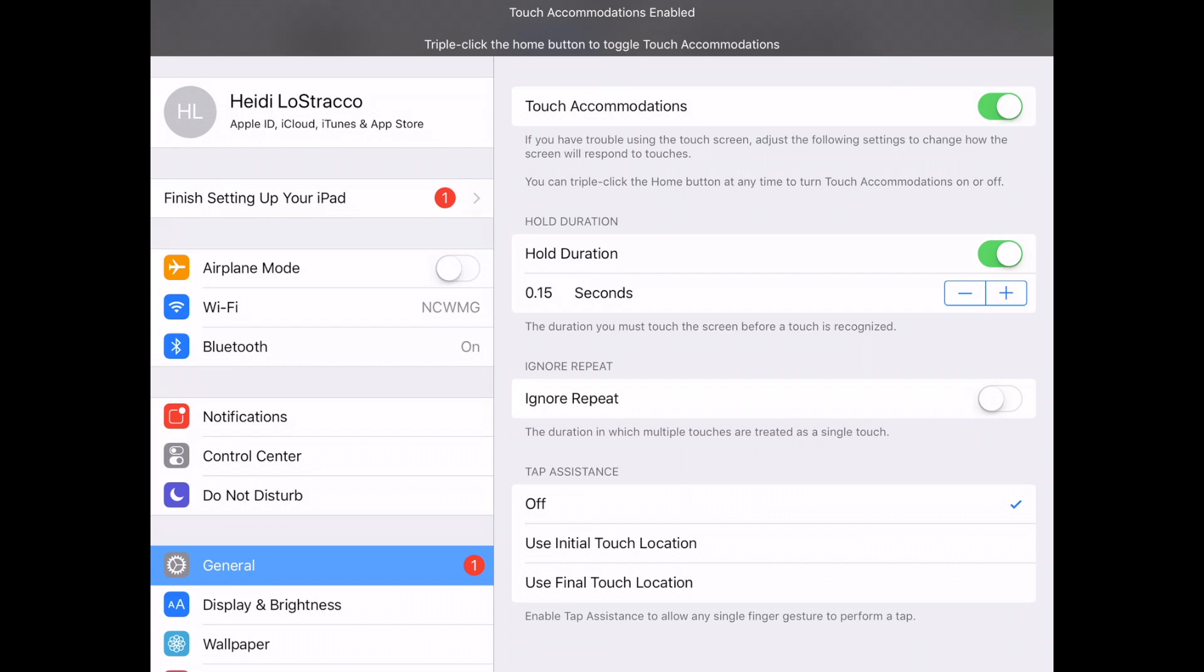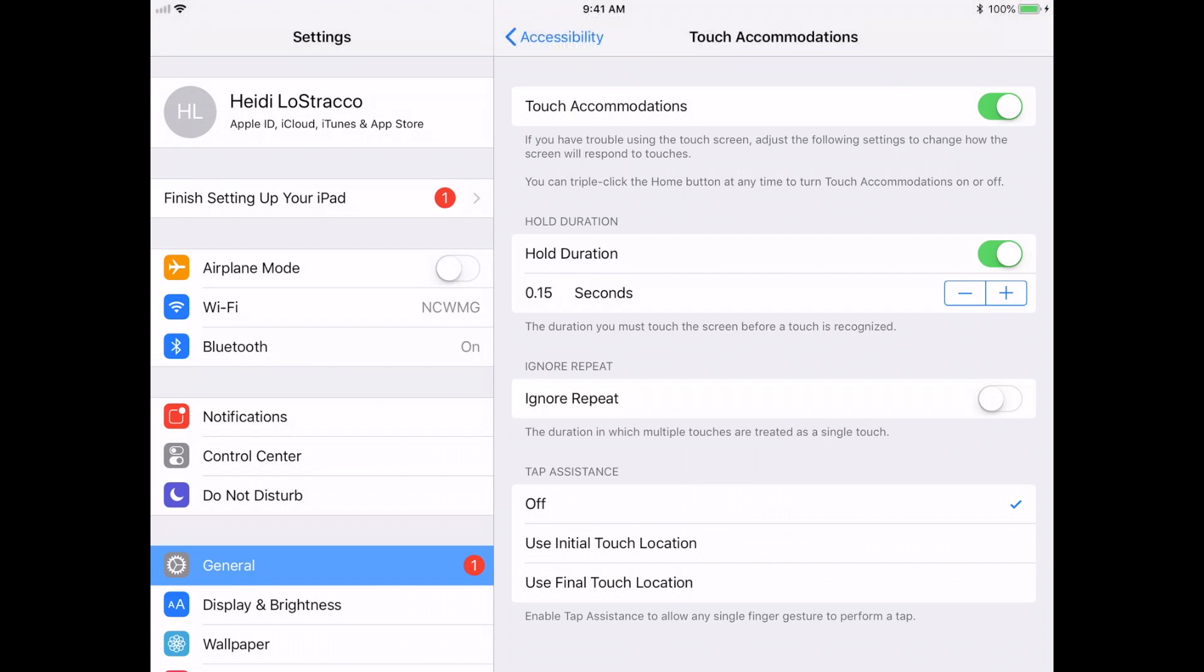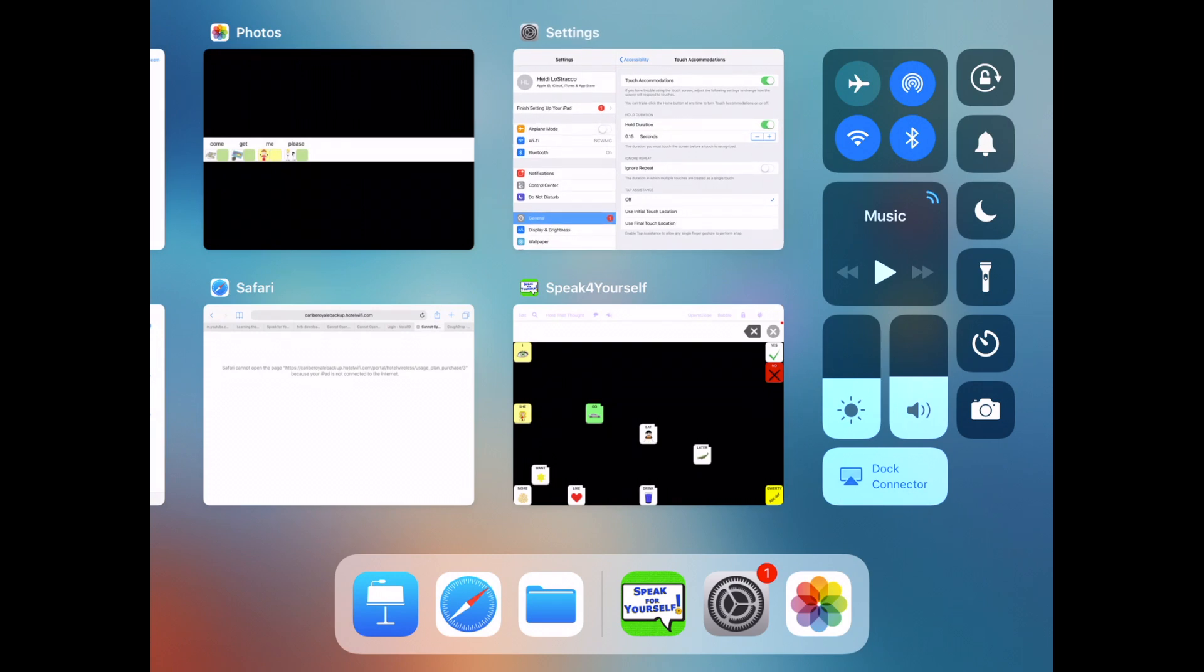And then you're also going to go to hold duration or you can go to ignore repeat. So in that example that I was giving where I was hitting the button over and over again, you can control that so that a student is not able to do that by going to ignore repeat. The other thing that you can do is go into hold duration, so you see I have that turned on and I have it turned on to 0.15 seconds. I really think that what the iPad does is it rounds up so when it says 0.15 seconds it's really 0.2 seconds, and I'll show you why I think that in a second. So once you do that then you can say okay I'm done and then you can scroll up here and go back in to speak for yourself.